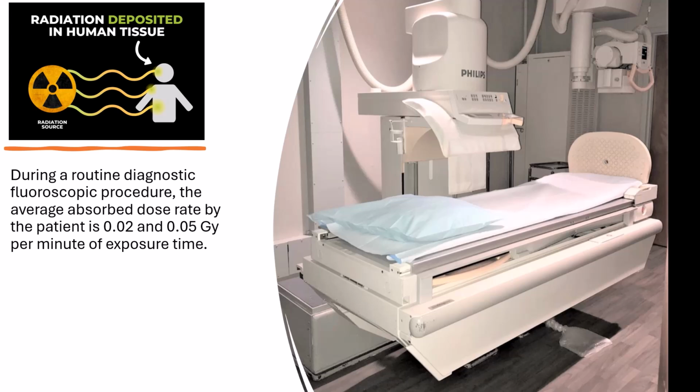Most procedures can be done on a single exposure or a rate of 1 to 2 exposures per second while maintaining adequate image acquisition. Typically, this is between 0.02 and 0.05 grays per minute, which in the olden days was 2 to 5 rads per minute.